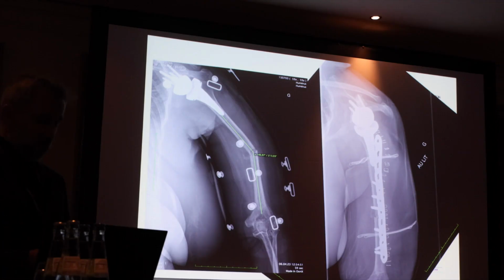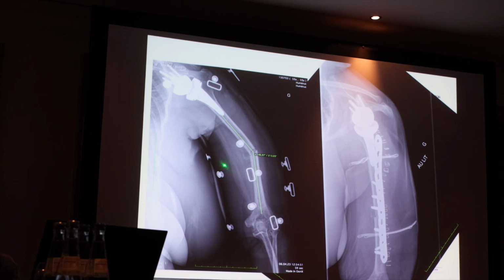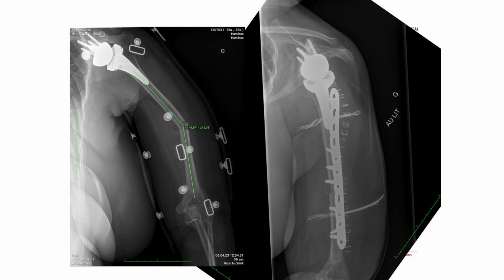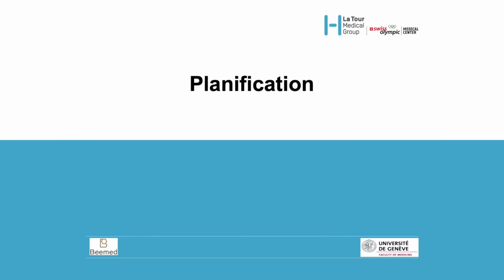And this is a case that I did on Tuesday. So see, it was a non-union of this mid-shaft fracture, and I used this plate. Okay, the result is fine, but I only have one screw because the design of the plate is not great, and I couldn't use a long Philos because I did a measurement and it was too short.